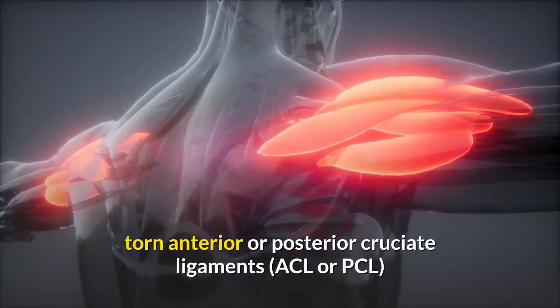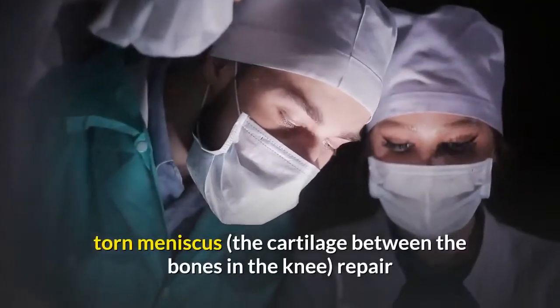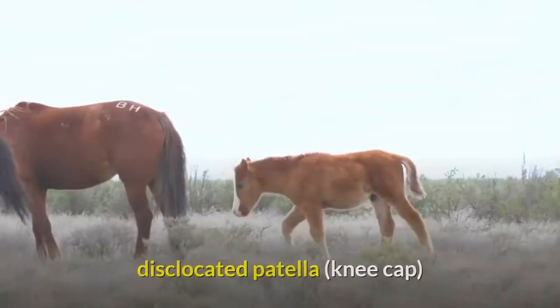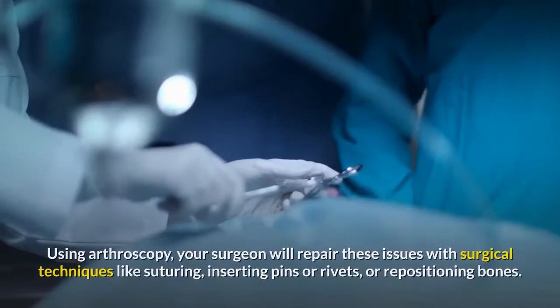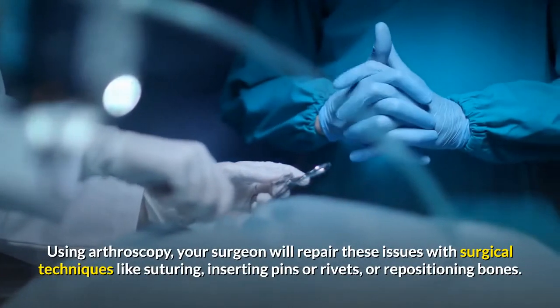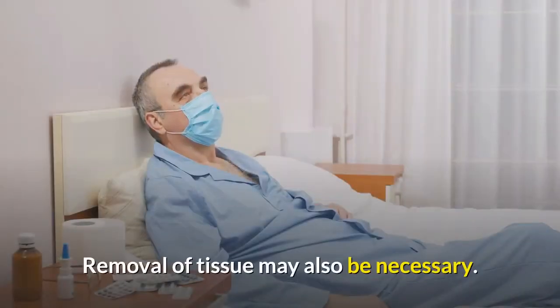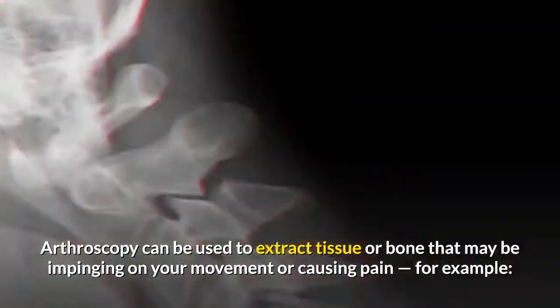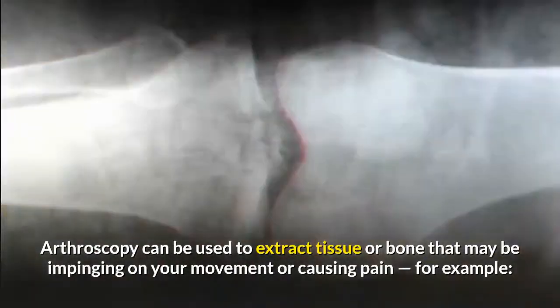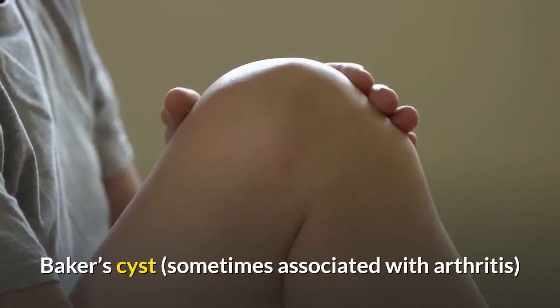Torn anterior or posterior cruciate ligaments (ACL or PCL), torn meniscus — the cartilage between the bones in the knee — fractures, and dislocated patella (kneecap). Using arthroscopy, your surgeon will repair these issues with surgical techniques like suturing, inserting pins or rivets, or repositioning bones. Removal of tissue may also be necessary. Arthroscopy can be used to extract tissue or bone that may be impinging on your movement or causing pain — for example, loose bodies of cartilage, Baker's cyst (sometimes associated with arthritis), or swollen or inflamed synovium, the lining in the joint.